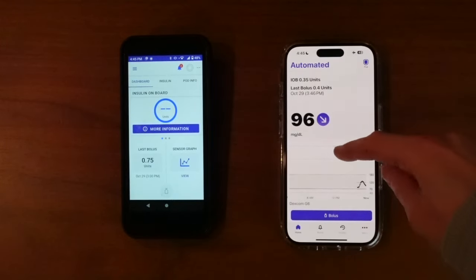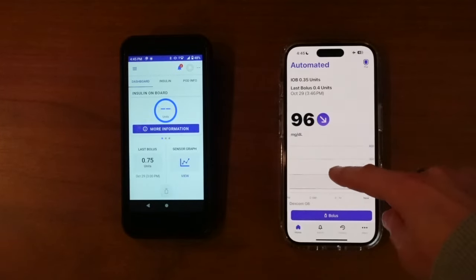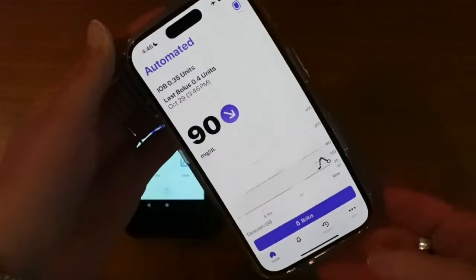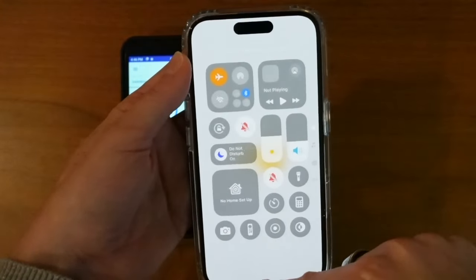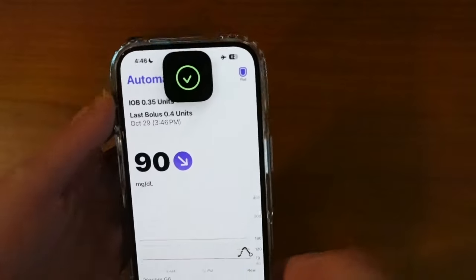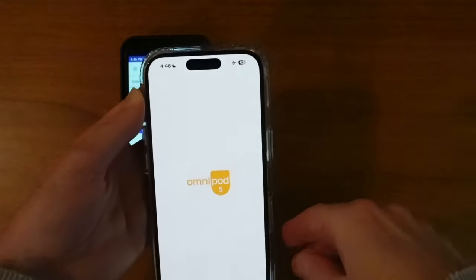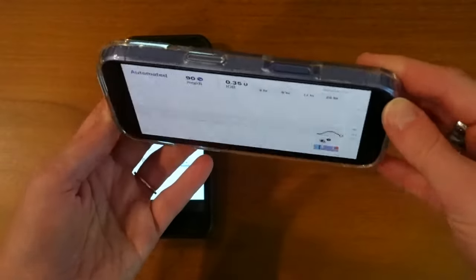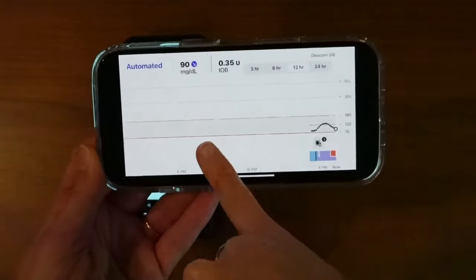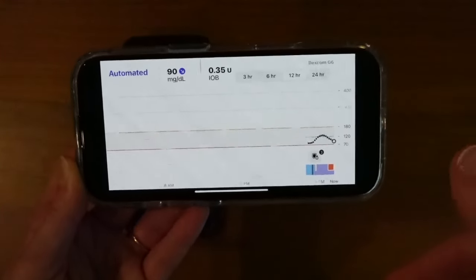Another thing: you can tap the Dexcom screen down here if you want to see different time ranges, and you can turn the phone on its side to get a more full view of the graph. However, that's not going to work if you've got it locked in portrait mode. So there's the famous face ID — even though I flipped it and turned off portrait mode, it's asking for face ID. But now that it's unlocked from that mode, I'm getting that full graph. I'm not sure if there's a way to access that graph without taking your phone out of lock mode, which I know a lot of people utilize. I'll keep you posted on that.